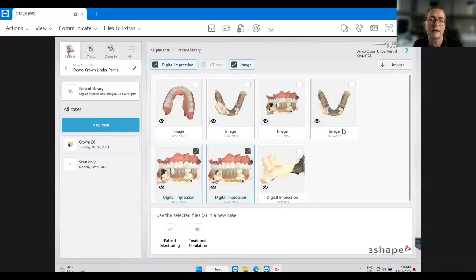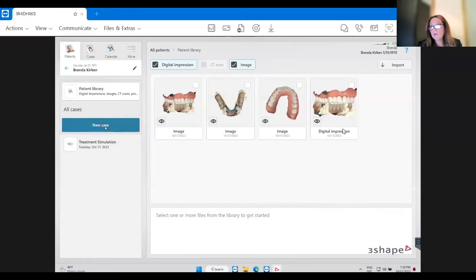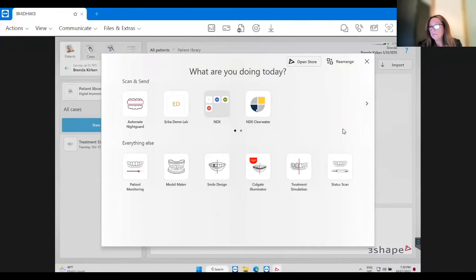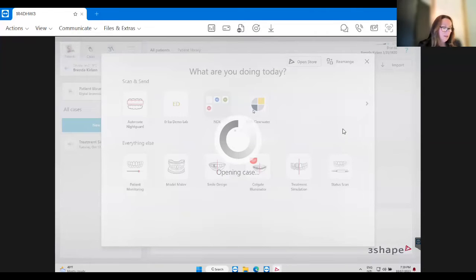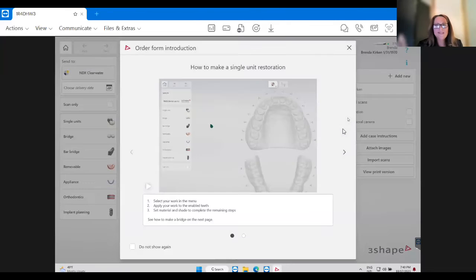Great. Thank you. So the next that we can do is we are going to scan for a denture. I'm going to stop sharing my screen for a second. Well, you can see my face, correct?